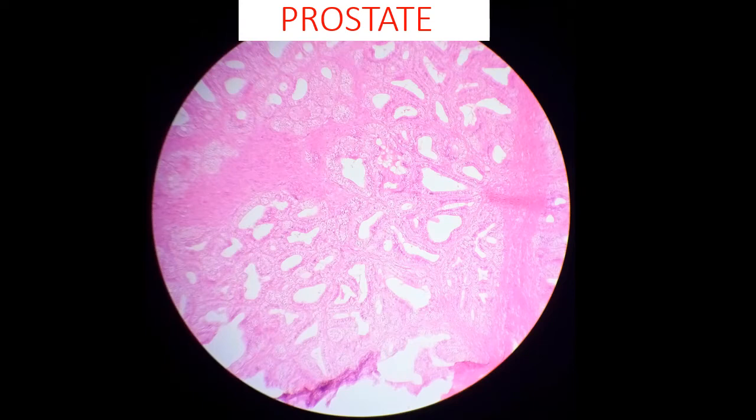So prostate identification: try to observe this prostate. It is a fibromuscular glandular male accessory sex gland. Fibro means the fibrous part, muscular means smooth muscles, glandular means glands can be seen. Which glands? Prostatic glands can be seen. These are all the prostatic glands, which consist of acini or follicles lined by simple columnar cells.